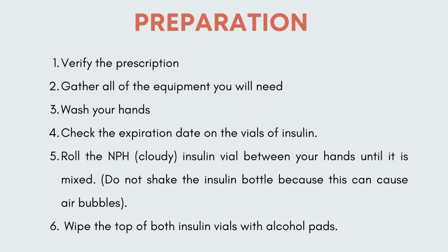And then your NPH, remember, it's going to be cloudy. So you want to make sure you roll it. It's a suspension. So you want it evenly distributed, but you don't shake it. Don't shake the insulin. You're going to put air bubbles in it, and that's not good. So instead, you just put it in between your palms, and you can roll it and roll it and roll it until it is evenly mixed together. Now you're going to grab both of those vials and wipe the top off with an alcohol pad so it is clean, and you just let it air dry by itself.